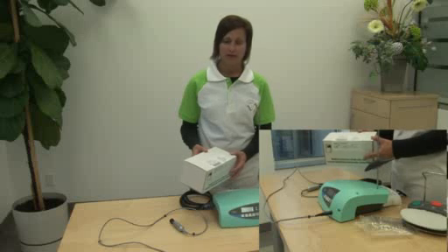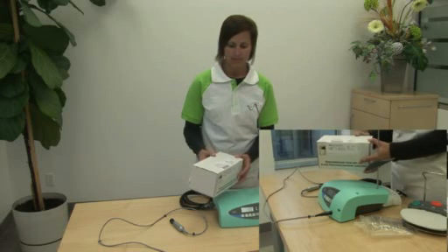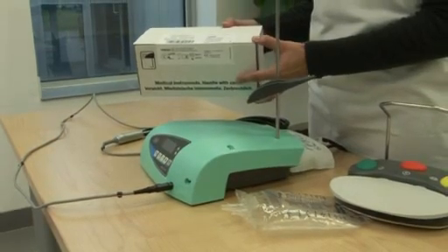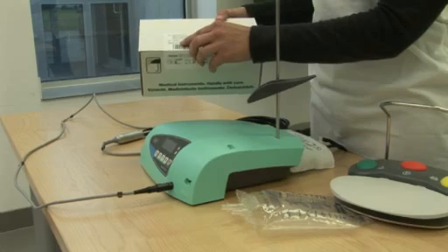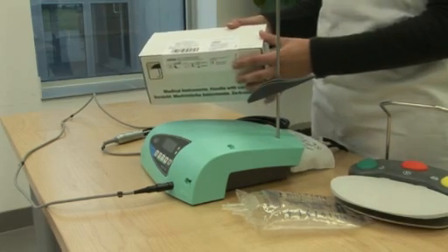In your implant med carton you received a starter kit of three irrigation tubing sets. For a reorder, please refer to your instruction for use manual or on the box it has a reference number. In the new cartons for reorder it comes with six opposed to three.